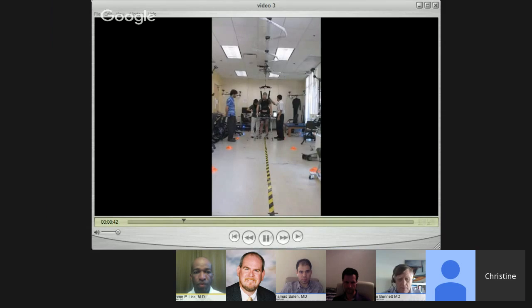Wonderful. So right now I told him to relax and remain idle. So he's just standing there, being stimulated just to stand. Then in a few seconds, I'm going to ask him to start walking, where he again just attempts to walk. The brain-computer interface figures out you're attempting to walk, and then immediately sends a control signal to the functional electrical stimulation device to allow him to walk again. So as you can see, he's able to actually walk.